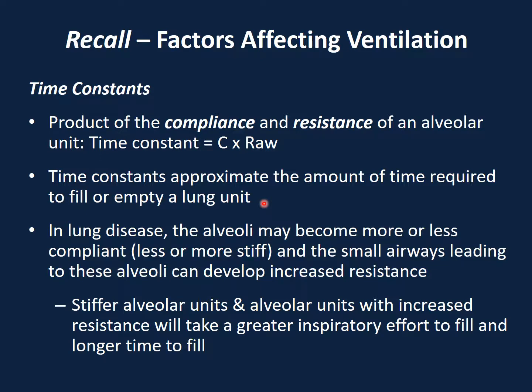Some units may only start to fill in the 3rd second of the inhalation. Okay, so that's because of where they are situated, right? So that's the reason why when you recall, when we teach deep breathing exercises or thoracic expansion exercises, we always stress that the inspiratory time to take in a deep breath or to do the thoracic expansion exercise is a minimum of 3 seconds. So preferably 3 seconds or more to slowly take in the deep breath so that it allows different lung units with different time constants to open up. Okay, and that's when we really help with reversing atelectasis or preventing atelectasis. Okay, so please remember that.